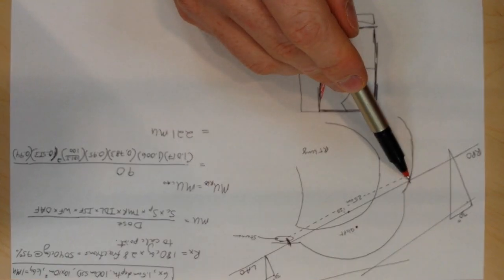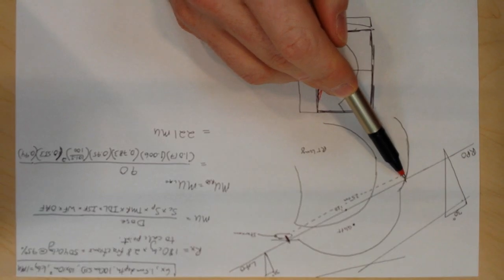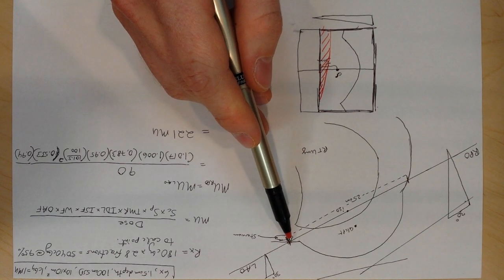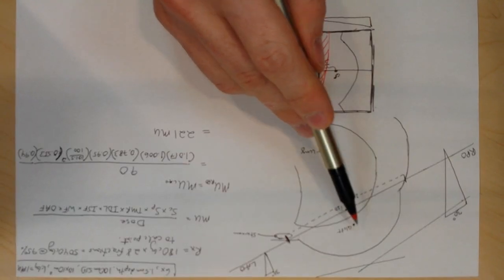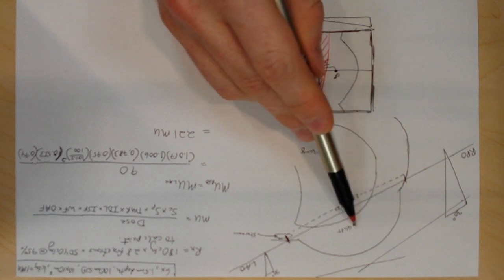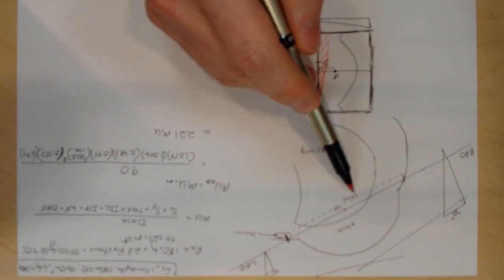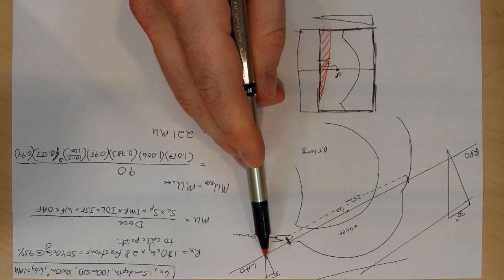My patient separation is 25 centimeters from where my RPO intersects the patient body to where my LAO intersects the patient body. Note that my depth of calculation is not going to be 25 divided by 2. It's going to be the depth of the calc point, which is going to be on the thinner portion of tissue, so my depth is actually going to be less than 12.5. I have 30-degree wedges, and I'm going to assume equal weighting because I don't want to do 2 calculations. I don't have the time.